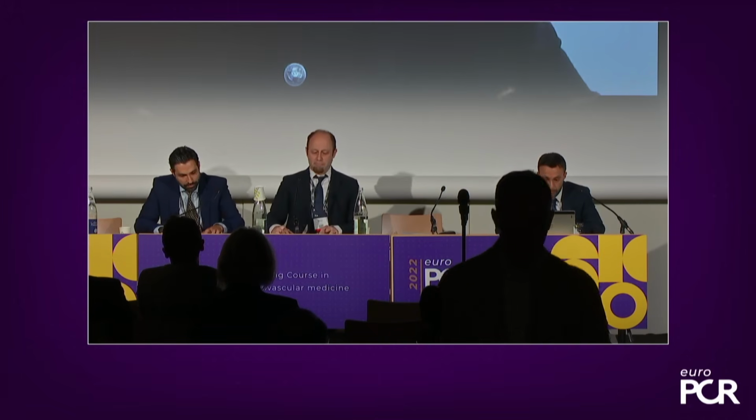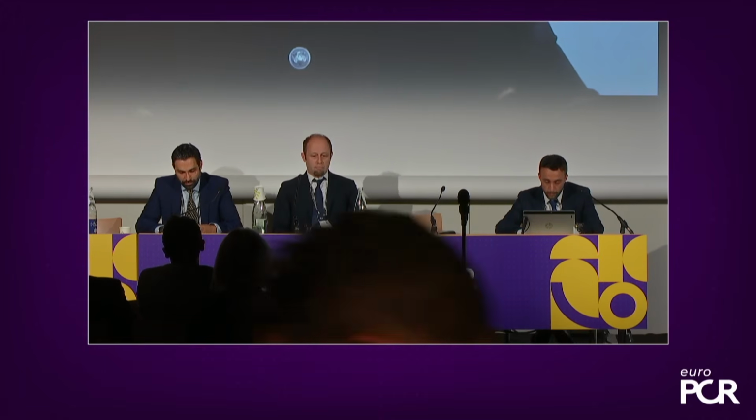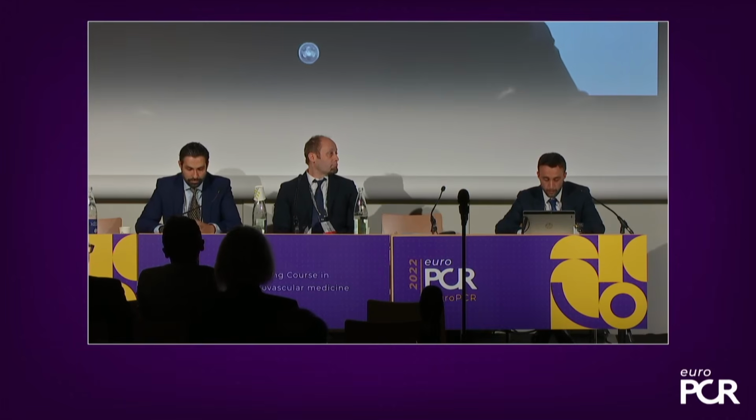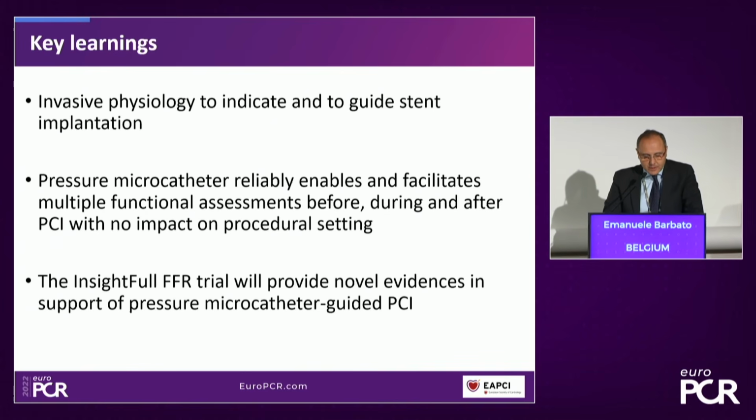Yes, if we can have the key learning slide on the screen, just to summarize what we discussed backstage. I will just go through them. I hope you would concur that invasive physiology is here not just to indicate, but also to guide stent implantation. That was really the topic of this session. We believe that the pressure microcatheter reliably enables and facilitates multiple functional assessments before, during, and after PCI, as we had the opportunity to discuss, with no impact on the procedural setting. The insightful FFR trial will provide novel evidence in support of pressure microcatheter guided PCI.